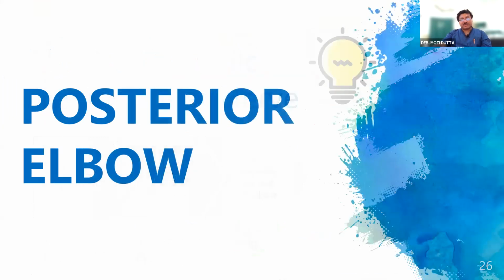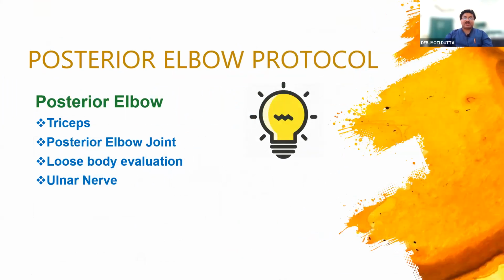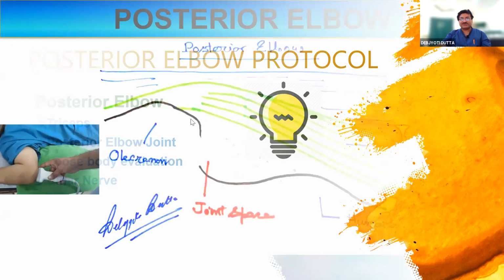Now coming to the posterior elbow. What are the things we need to check in the posterior elbow? First, we need to check the triceps. The triceps has three heads, but here we will be able to see only two heads actually joining to the olecranon. Next is the posterior elbow joint, where we will be able to see the olecranon fossa. We need to evaluate for loose bodies, and the ulnar nerve again in the posterior medial part. I have covered that in the medial portion of the elbow.